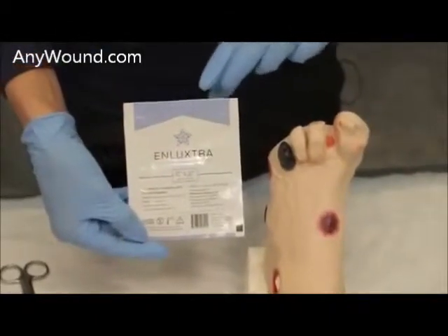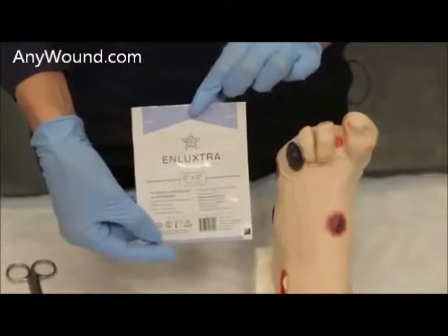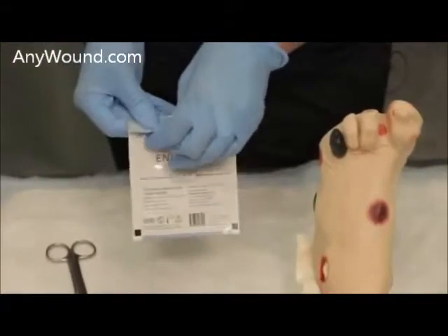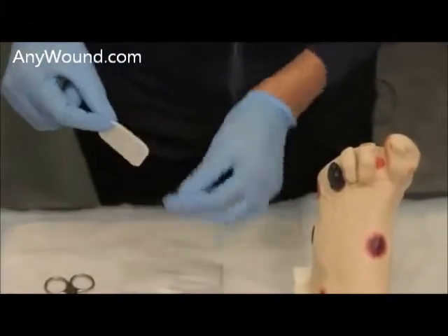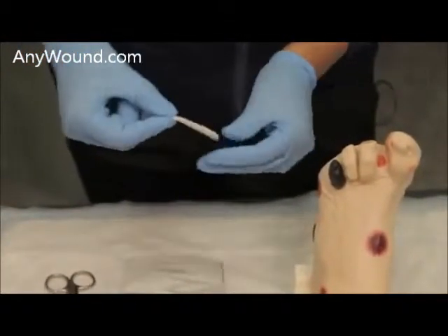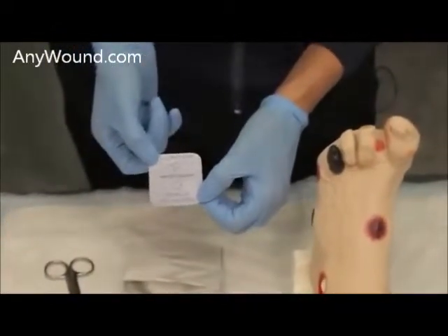For this particular application, we'll utilize a 2x2 Enluxtra dressing for this web space. First, open the dressing, reach in for the edges — this is the fiber side, this is the backing side, which clearly states 'this side out.'